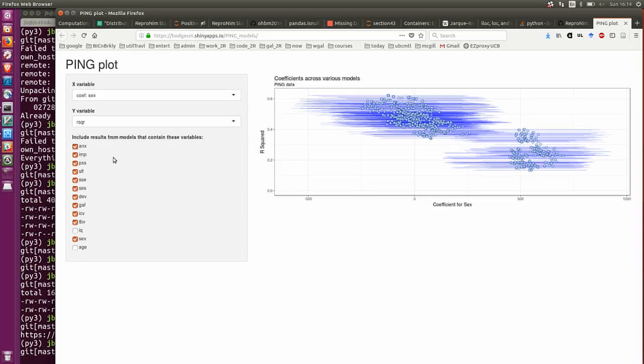And there is no magic to this. The correction is based on the distribution of the maximum statistic, which is the same correction that we already use to correct across multiple voxels, right? With the distribution of the maximum across all the voxels in the brain. So in this case, we would use it across all the models. So after building the empirical distribution of the maximum across all the models, we get the p-value for all the models, correcting for the fact that you have looked into potentially hundreds of them. And the flag in this case is -corrcon, for correction over multiple contrasts, which encapsulates multiple contrasts within a model and also multiple contrasts across multiple models. That's interesting.